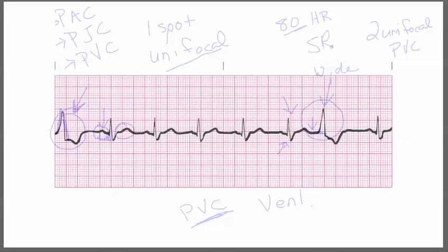So this is a sinus rhythm with two unifocal PVCs. That is how you can identify a premature ventricular contraction. They will look wide and bizarre, and they're going to look completely different from any other QRS complex. That's how we know these are PVCs — premature ventricular contractions.